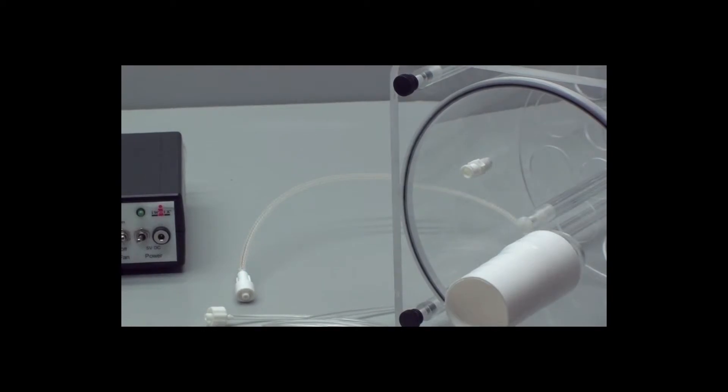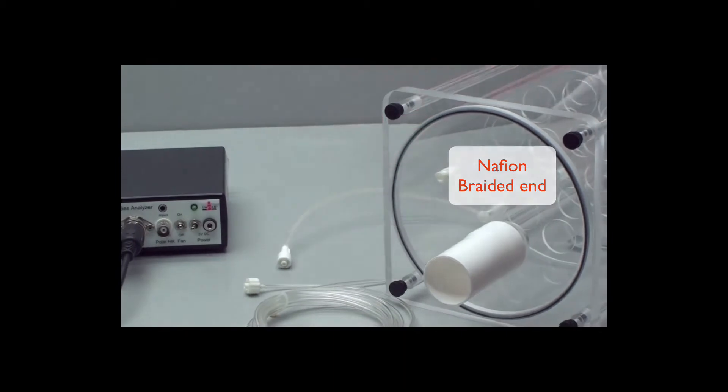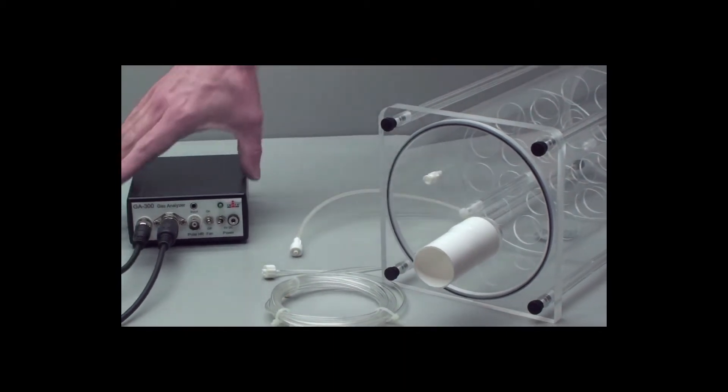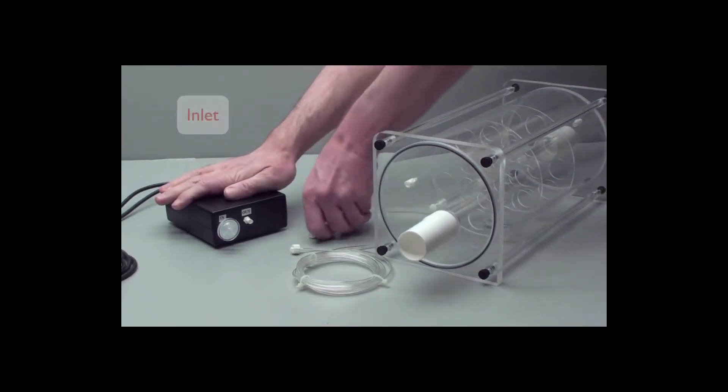With the Nafion clear tubing, find the braided end. That goes into the inlet of the gas analyzer on the back side.